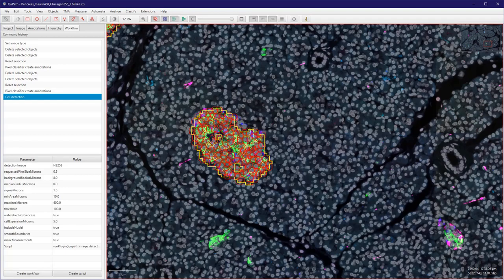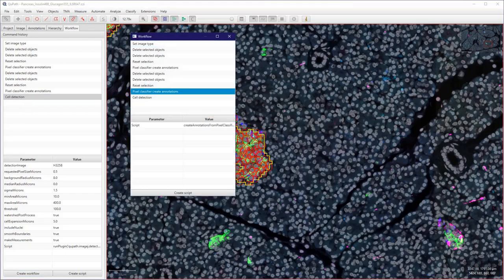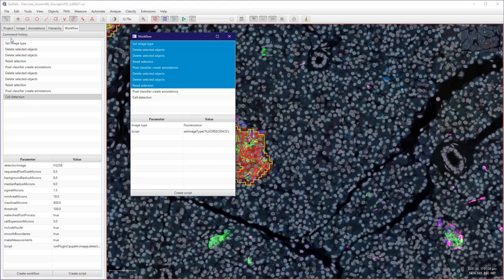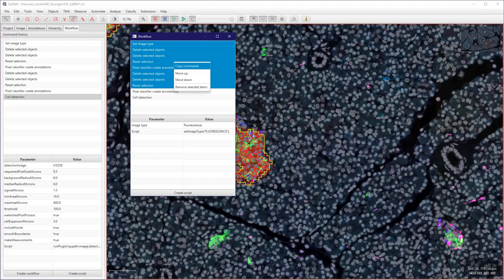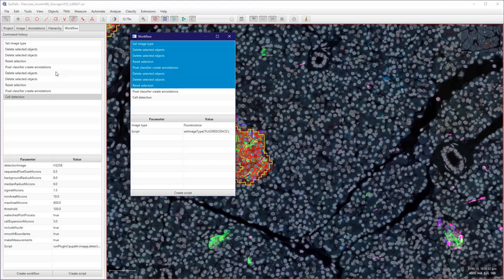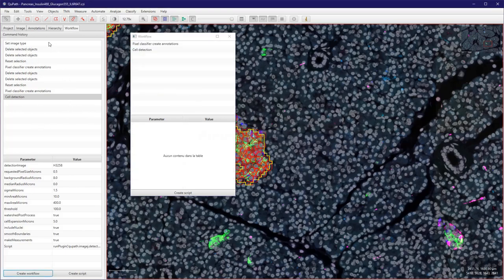So I can now create a workflow with only those two steps here. Let's just remove all the unnecessary steps here. So just for the command I shift-clicked my list here and right-click here to remove selected items.